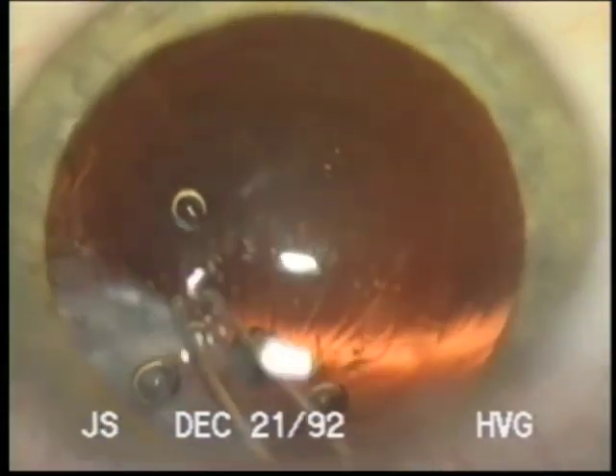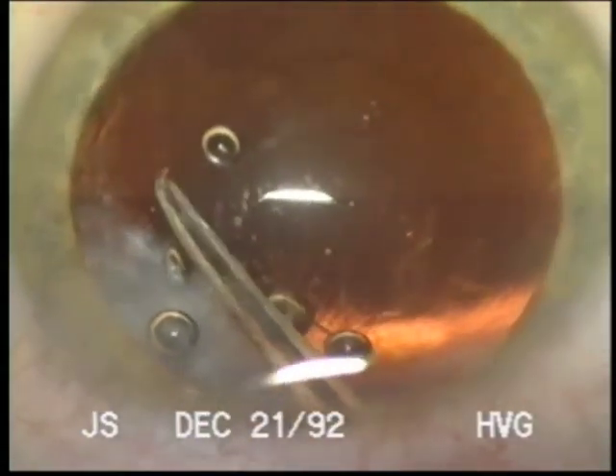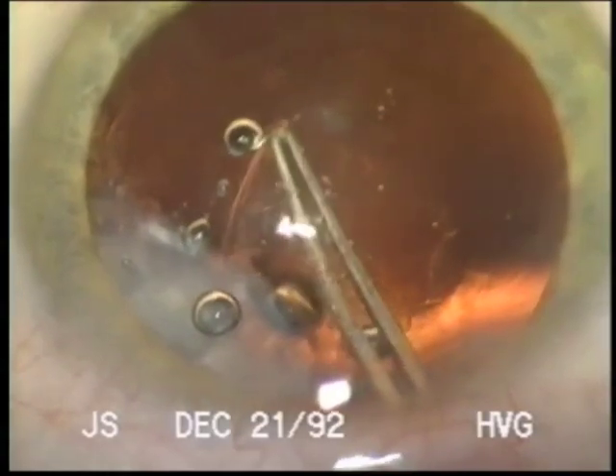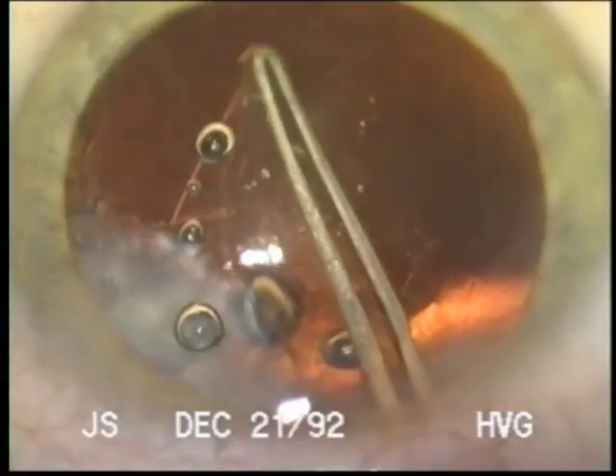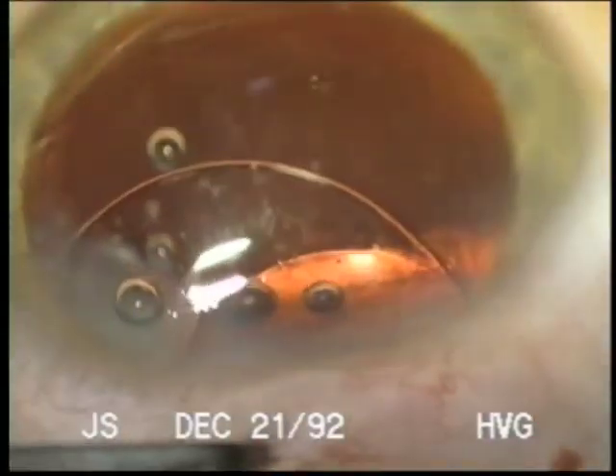This technique — hopefully nobody has to resort to it — but in situations where Vision Blue is not available, this will hopefully be helpful. Thank you.